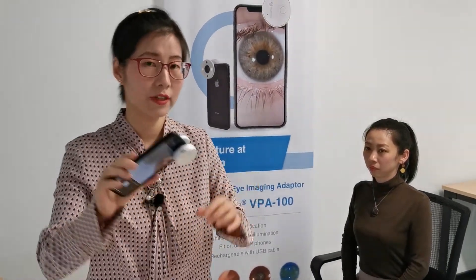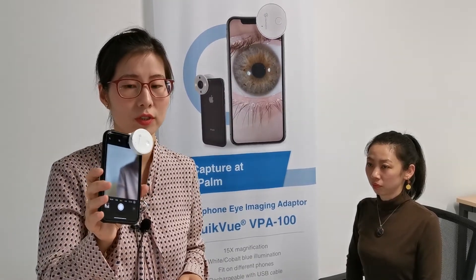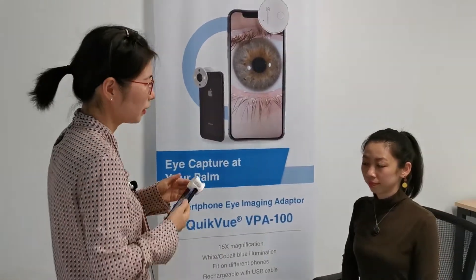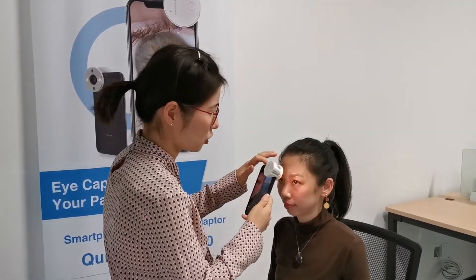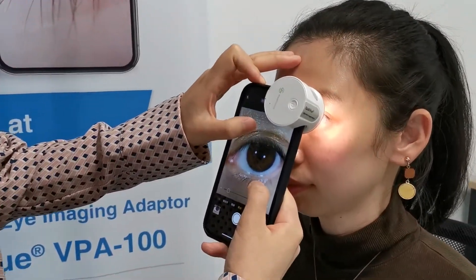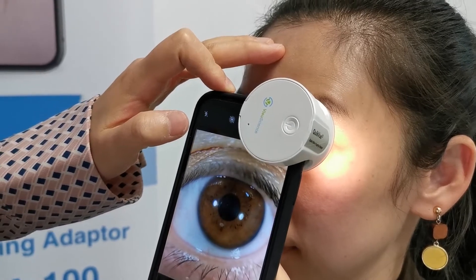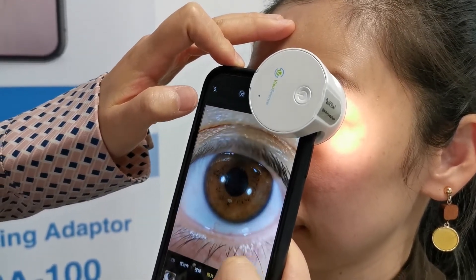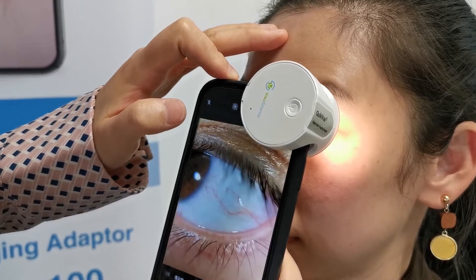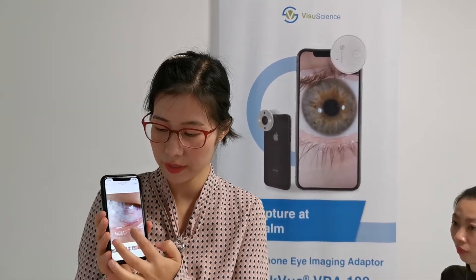After fixing the adapter onto the phone, you can see it is firmly attached and will not fall off, and it will be very friendly to your phone screen and phone case — it will not scratch it. Now let's turn on the illumination. We suggest you put your fingers on the patient's forehead to stabilize the phone camera, then go closer. The working distance is about 15 millimeters. You can see all the cornea details are clearly shown on your phone screen. Let's capture. With QuickView, you can capture all kinds of anterior segment pathologies easily.